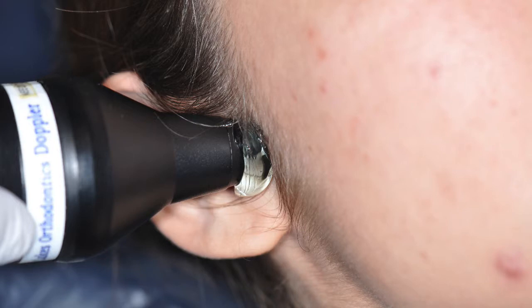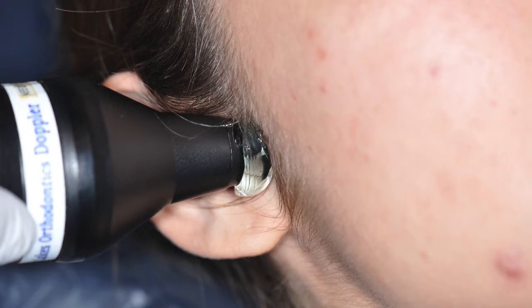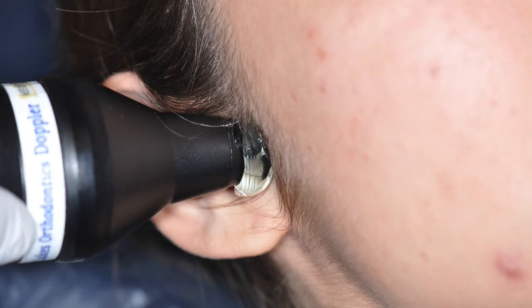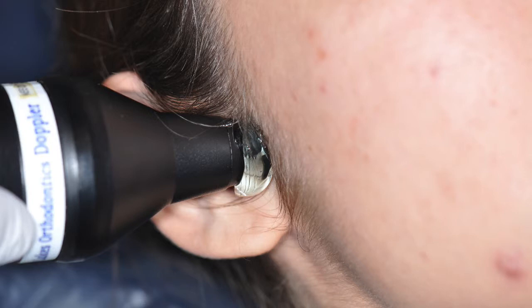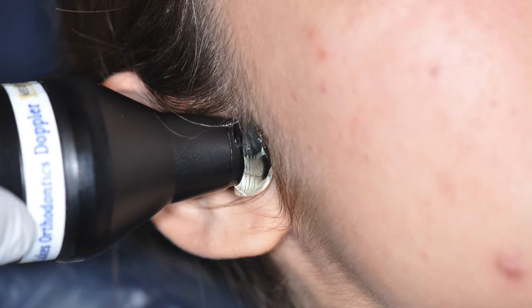I'm going to go through the demo with the actual Doppler sound for you once with Shelly. What I want you to try to do is differentiate between the background noise — one of the hardest things about a Doppler is background noise differentiation — and have that be different from when we actually hear crepitus. I'll go through it the first time and just let you listen, then we'll talk about it, and then I'll have the Doppler video play again so you can listen more specifically.